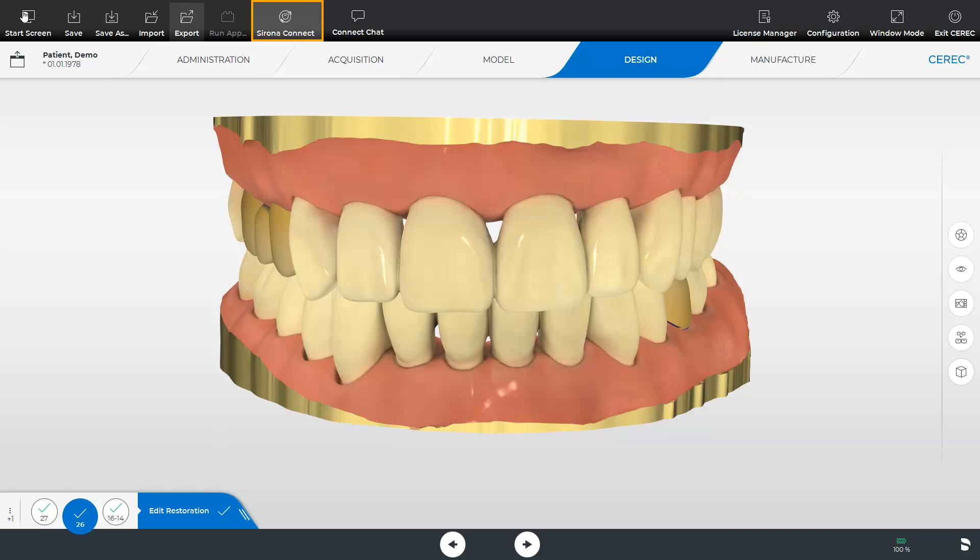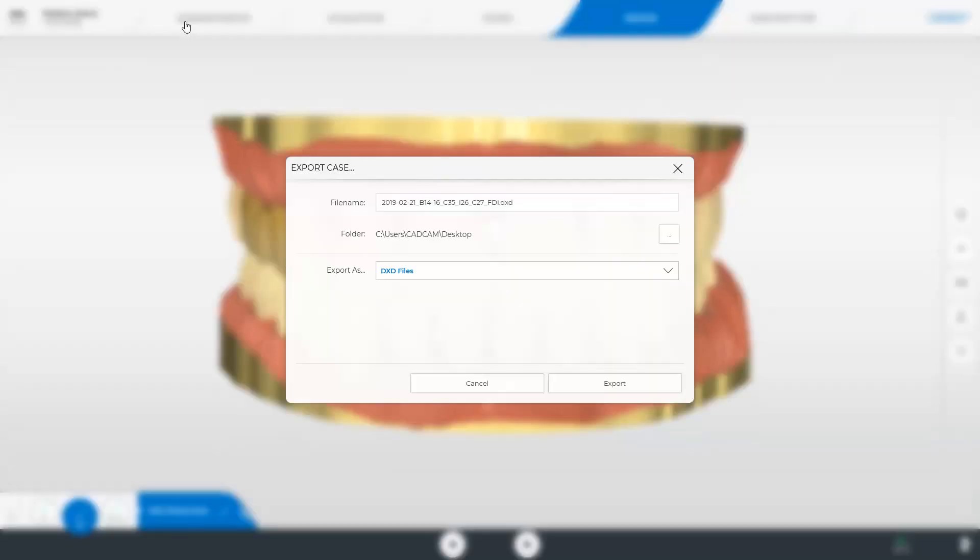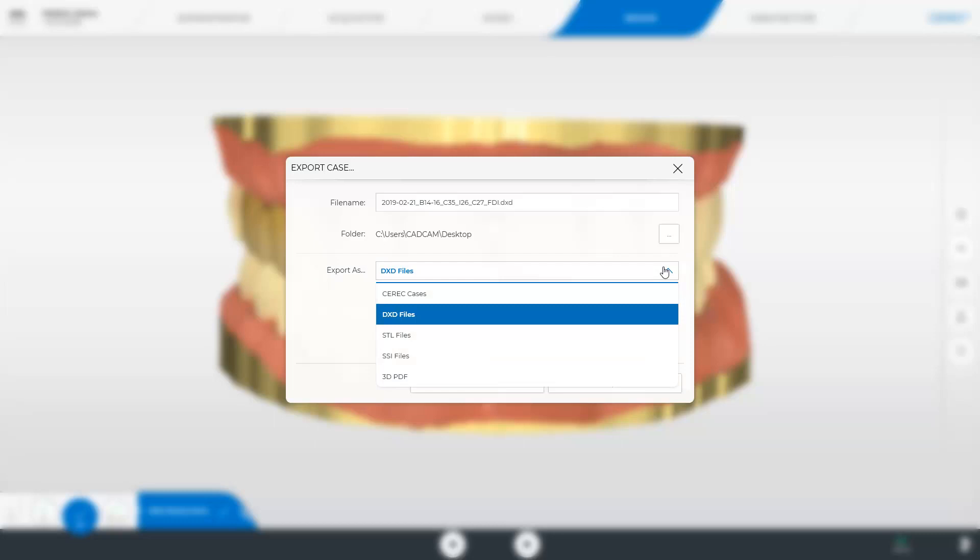When opening the data with any other lab software, only the model information is available. Next, we select the export option once again. After opening the drop-down menu, the same export formats as in the model phase are available. The only difference is that from this phase, exported DXD data will also include the restoration data, in addition to the model data.